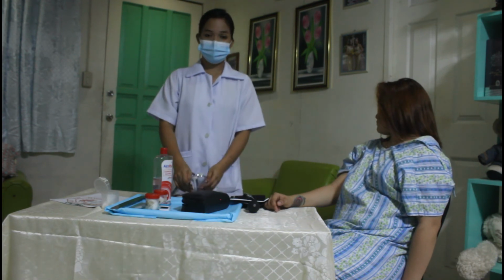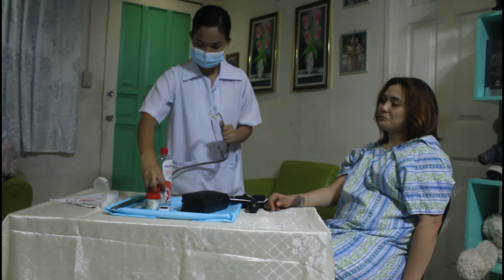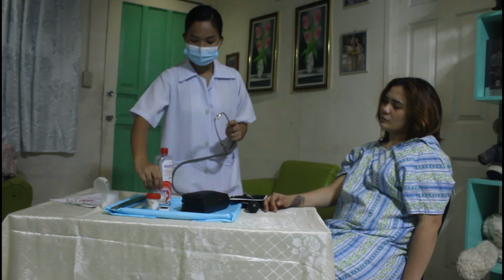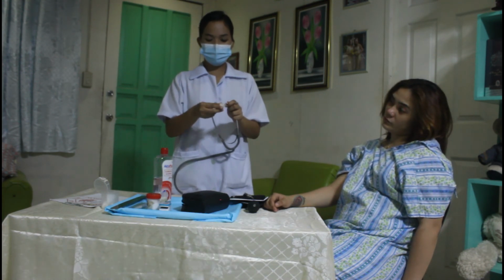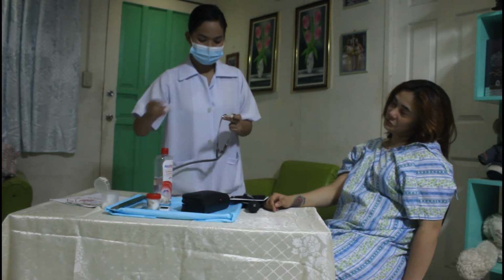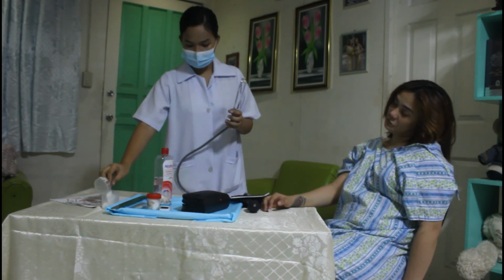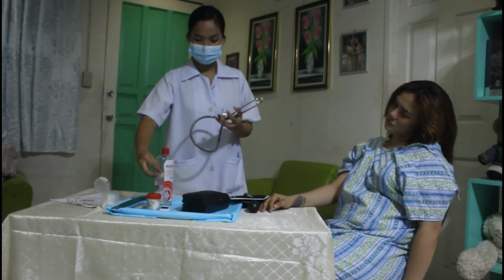Then, of course, we clean the stethoscope. So, starting from the side of the earpiece, then to the other side, and then the diaphragm of the stethoscope.